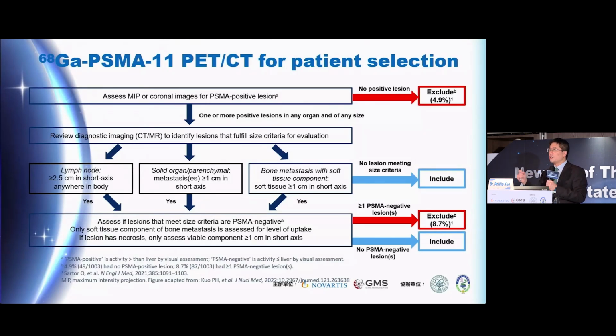Okay, and it also allows us, again, not to worry about small lesions. You can look at it and kind of compensate for partial volume effect, or somebody missing a 3 millimeter lesion that another reader caught. So you're only worried about things that are 1 centimeter or larger.